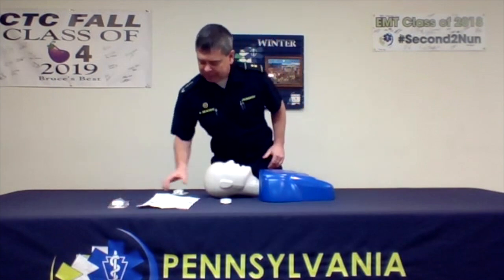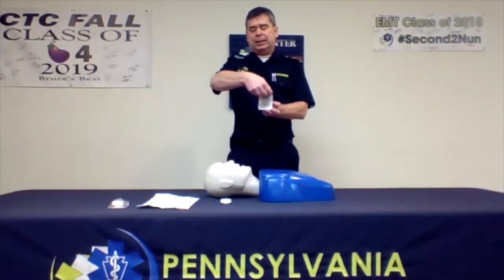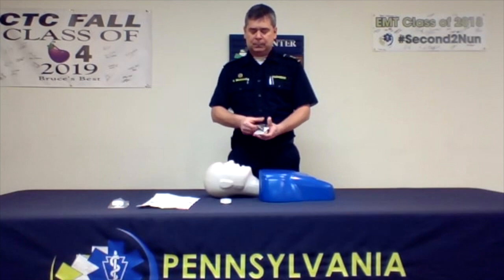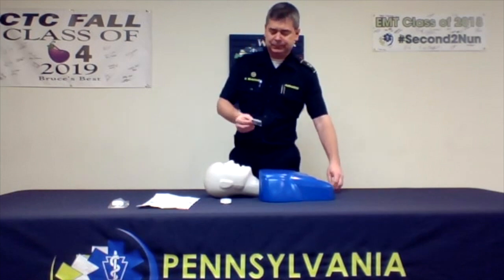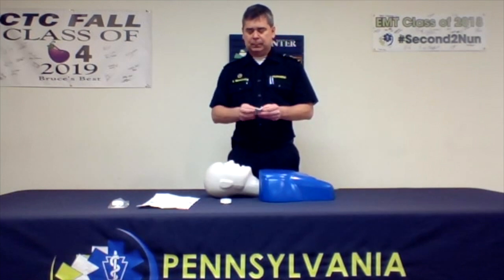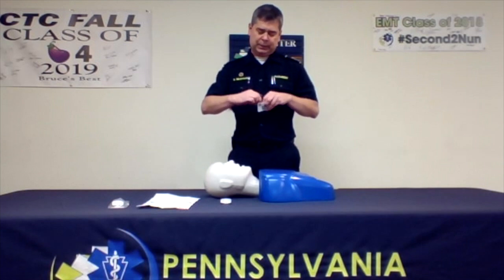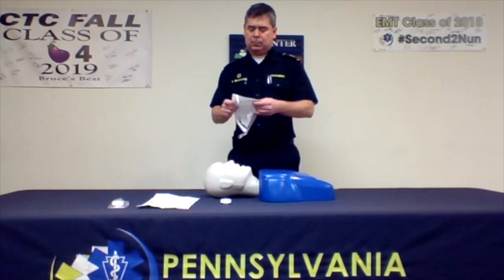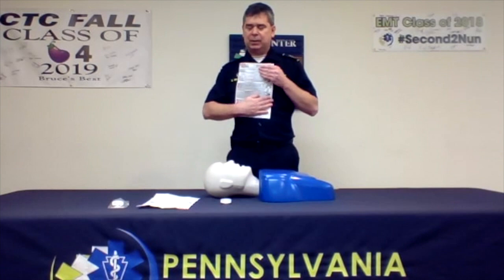To administer the medication, we're going to take our package. We're going to take the corner of the package and we're going to peel the back away. The instructions come with every dose of Narcan. Fold it out if you need instructions. And they appear just like the ones before.